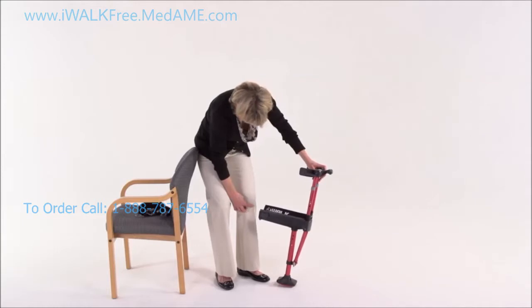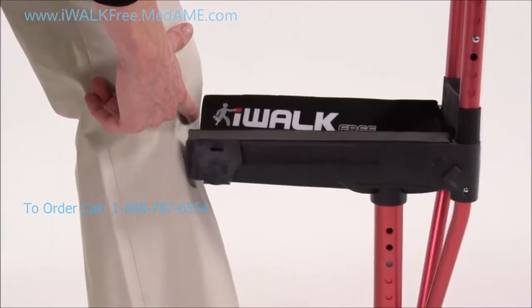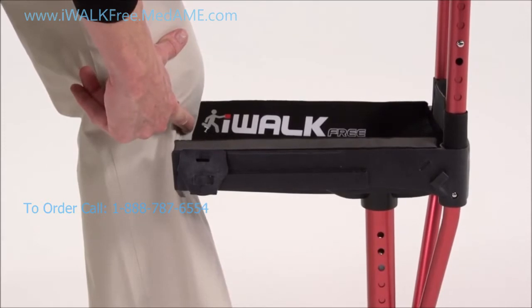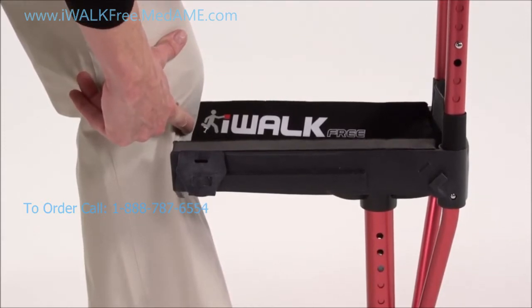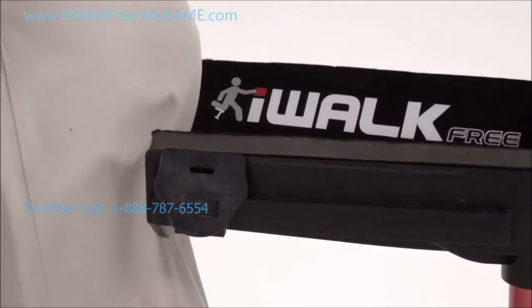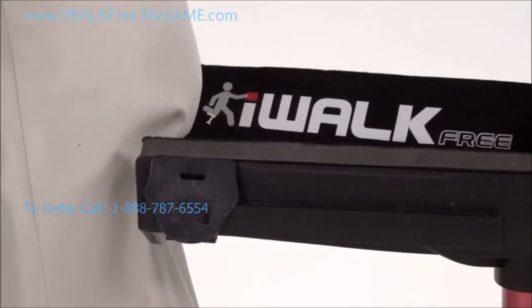Then either sitting or standing, hold the crutch in front of your leg with the back of the knee platform against your shin. Make sure the platform is level and line up the lower spot on the pad with your shin.